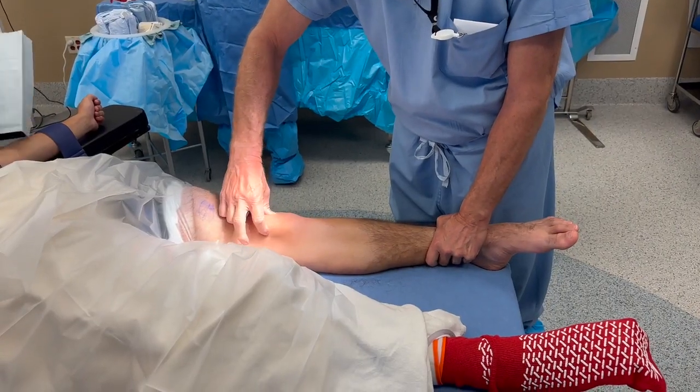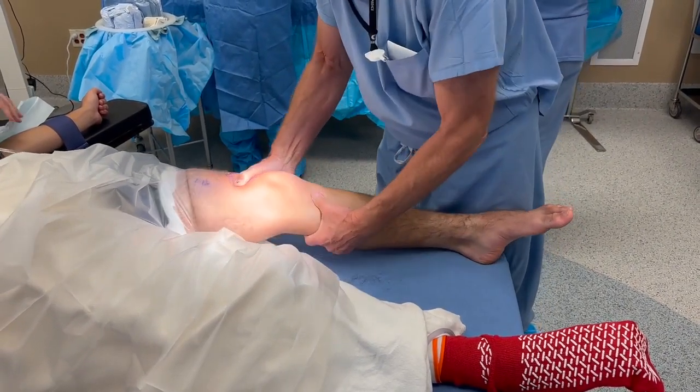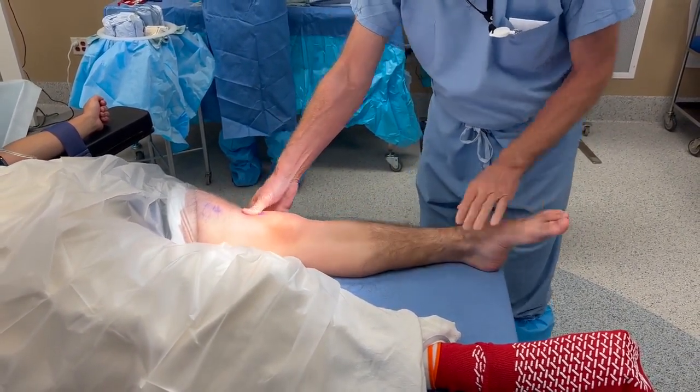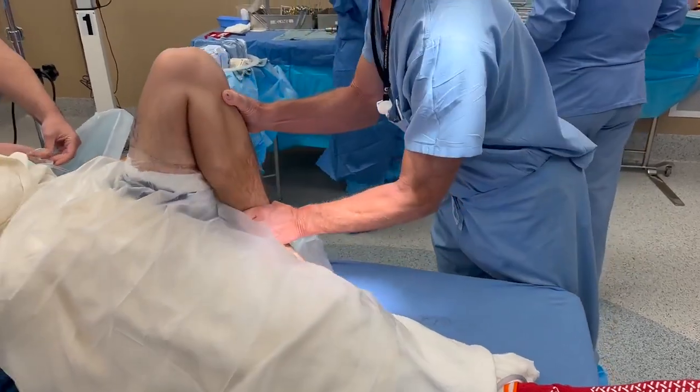The patient is positioned in a supine position on the operating table and a bilateral knee exam under anesthesia is performed to validate the clinical findings. A high left thigh tourniquet is placed and both legs are draped in a sterile manner.